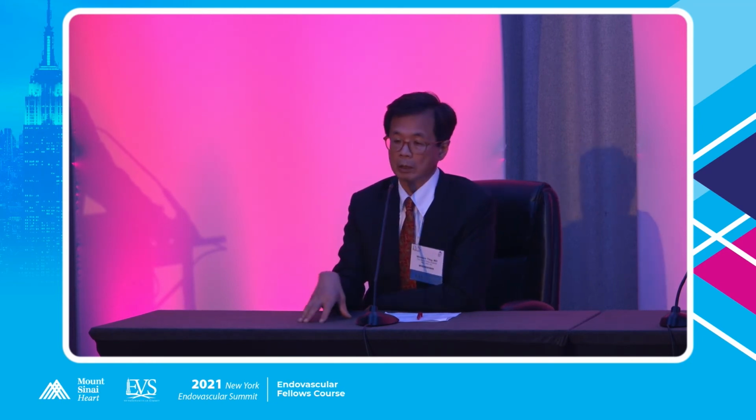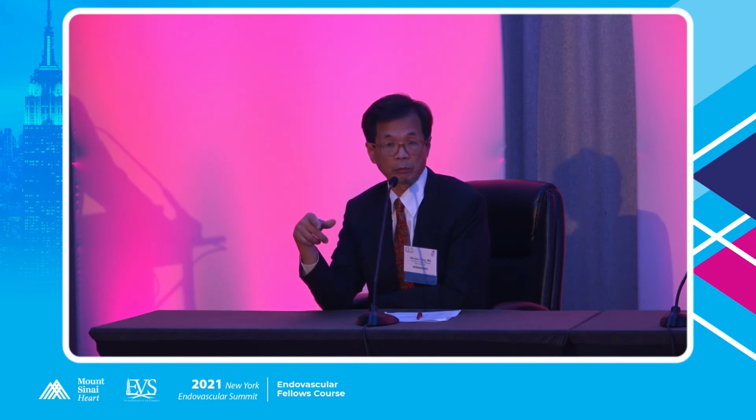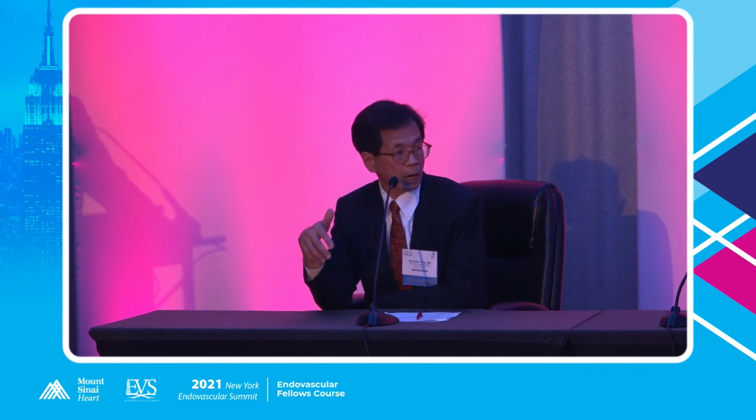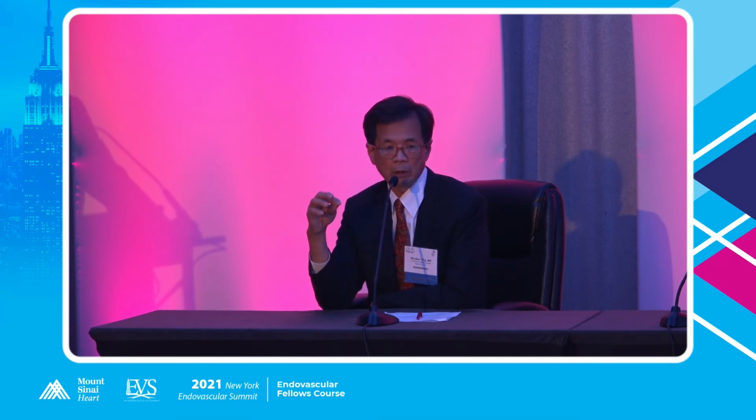Great question. Early on, when I did these DVT cases, I was putting a filter in because I was worried that during the procedure, trying to unload the amount of thrombus, some of it would embolize. And I realized after a while it doesn't happen. If it does happen, the amount of thrombus is really small, and it's really of no danger or long-term sequela to the patient.